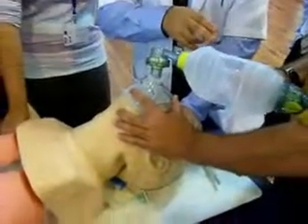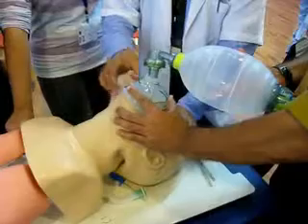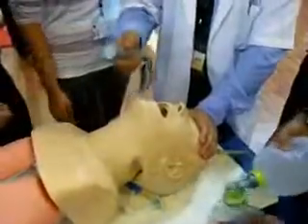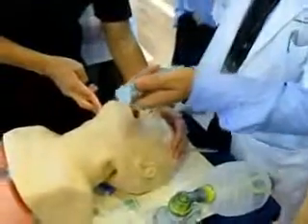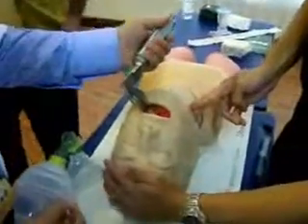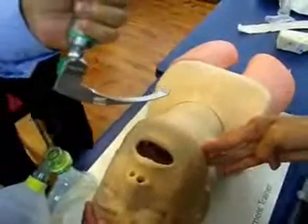The ambu bag is taken off. I will take the laryngoscope in my left hand. You can maintain the head tilt and chin lift position. I put the laryngoscope into the mouth — this is the Macintosh laryngoscope. I do a forward and upward thrust.